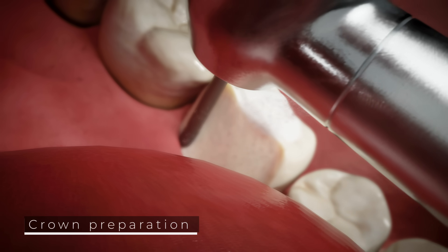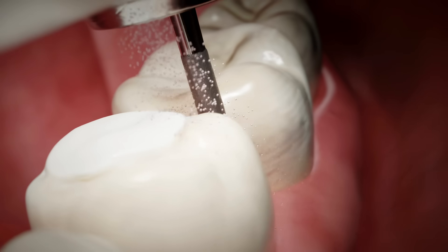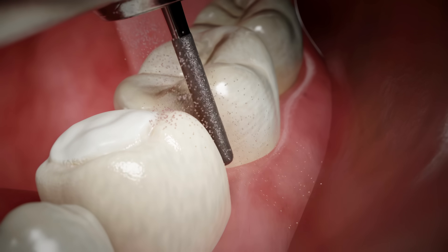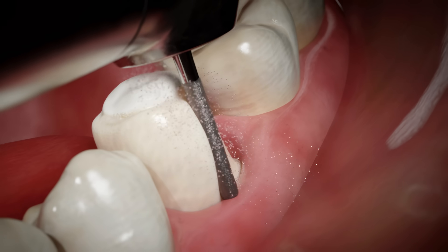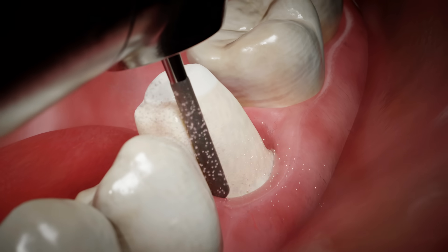To prevent tooth fracture and ensure proper distribution of occlusal forces onto the roots, the tooth is prepared and fitted with an artificial crown.